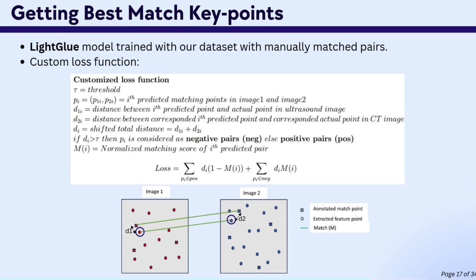Initially, LightGlue yielded suboptimal results for our datasets, so we followed a training approach for LightGlue, customizing the loss function and transitioning to a supervised learning paradigm by incorporating actual matching features into the loss function definition. I will now explain the details of this customized loss function.